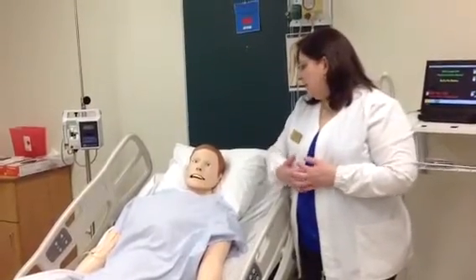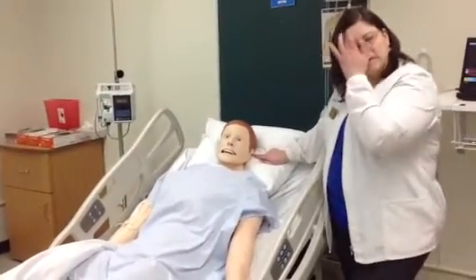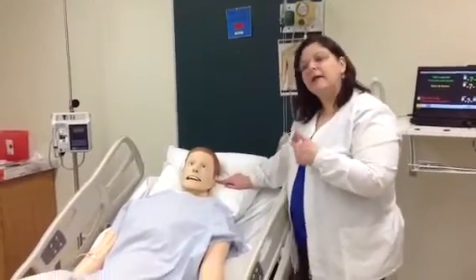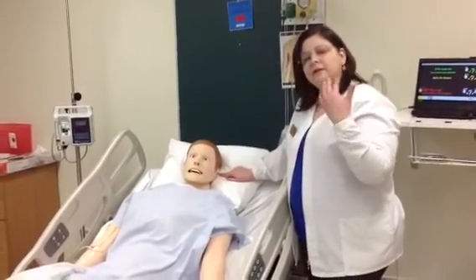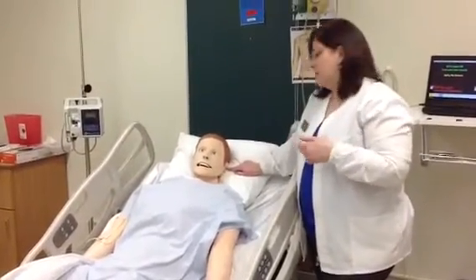In communicating with him, please notice that on his ears are speakers, so your clinical instructor that is behind the two-way mirror, even if you're speaking softly, can hear you. So that's a good thing to be aware of, that your clinical instructor is going to be listening to how you're processing what you're going to do next.